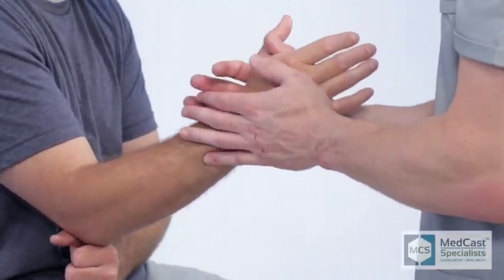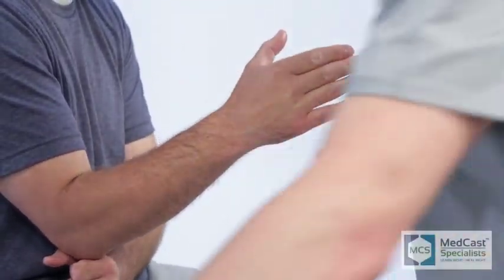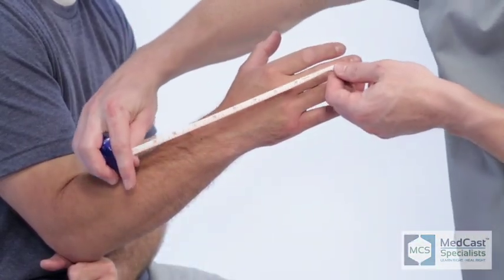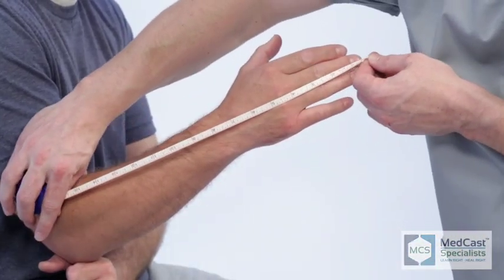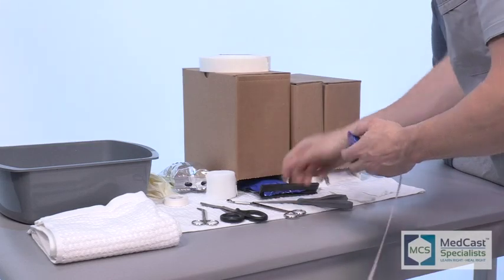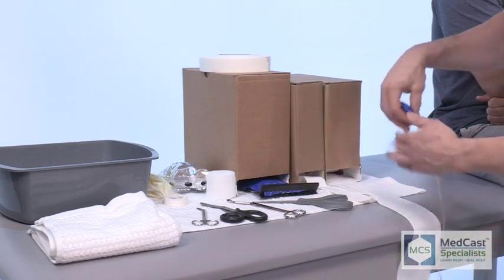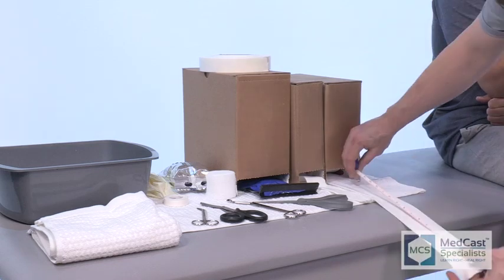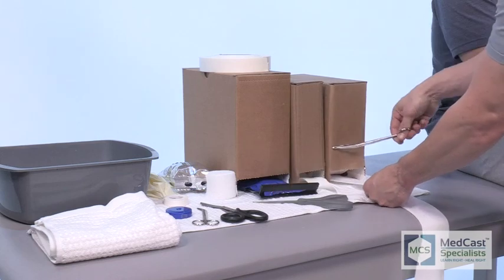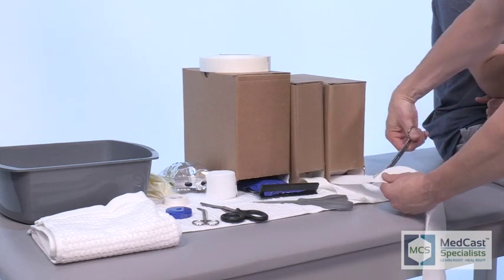In this video we're going to show you the application of an ulnar gutter cast. Ulnar refers to the ulnar side where the small finger and ring finger are, and we are going to be including the fourth and fifth digits on this cast. There may be times when a physician will ask you to put an ulnar gutter cast on to include the third, fourth, and fifth digits — the application will be the same, other than your stockinette will cover those three digits.